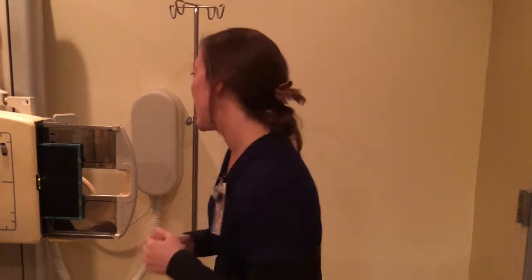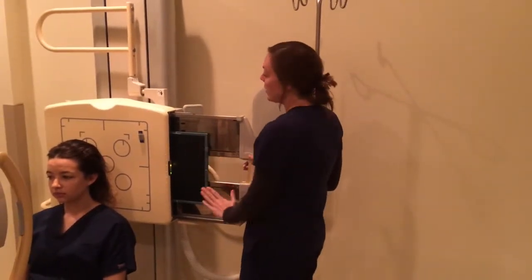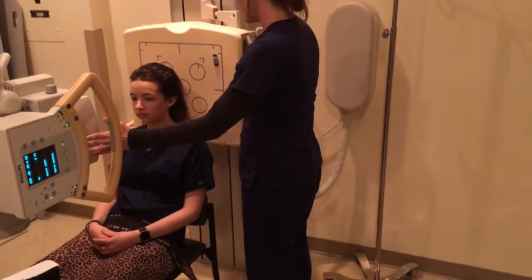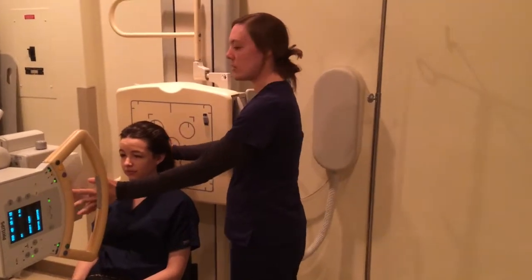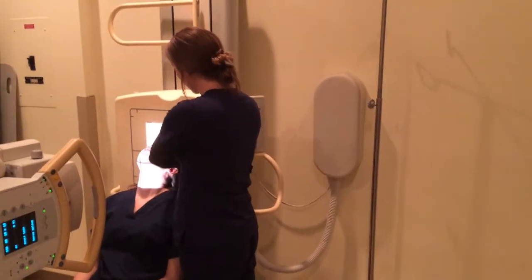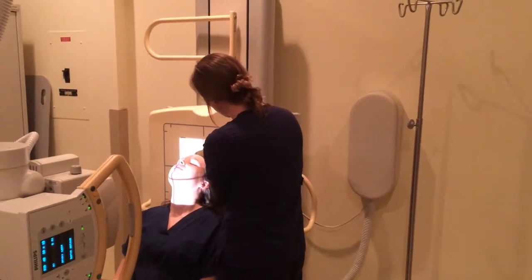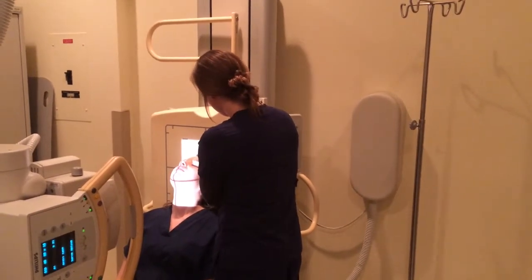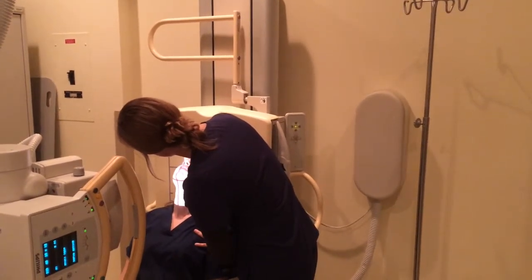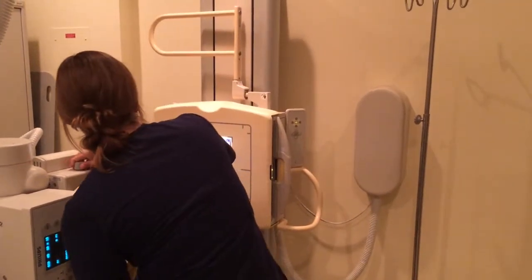So I'm going to go ahead and position my patient, still using the 10 by 12 in portrait orientation. I have shielded my patient. We're using an SID of 40 inches still. I'm going to place the patient's head backwards in position. This is the left side of my patient. I'm just going to get her centered. Okay, make sure I get the whole head.